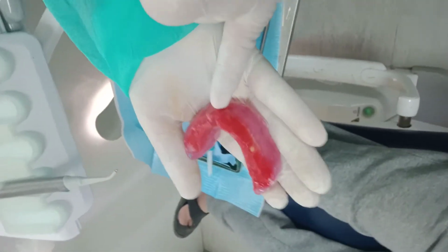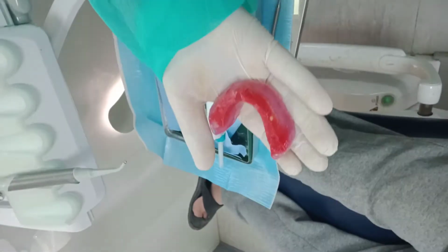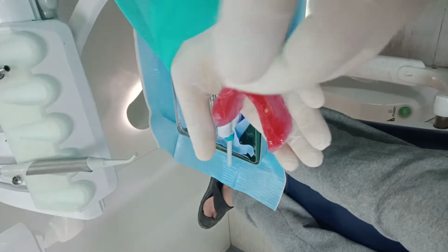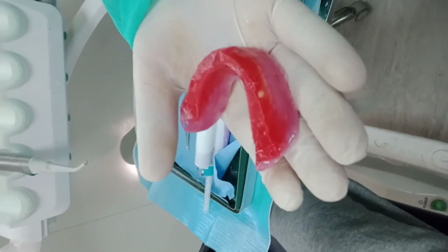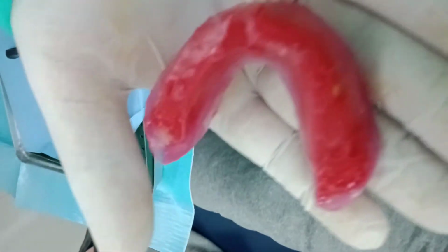Okay, you have done midlines and canine lines, but usually the technician doesn't follow them. They follow the natural teeth actually. Okay, they want to harmonize your midline and canine lines with the teeth present, so they might alter them. So the canine line itself is not an indication. In the complete denture patient, even in the complete denture patient, we're using canine lines and midlines where? In the upper mostly. Here we have natural teeth.